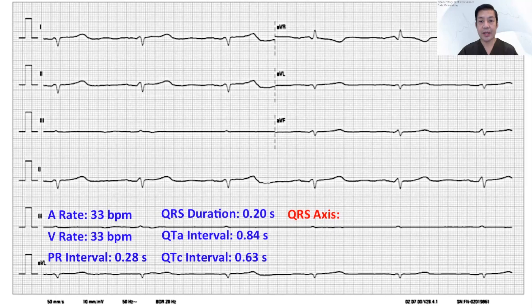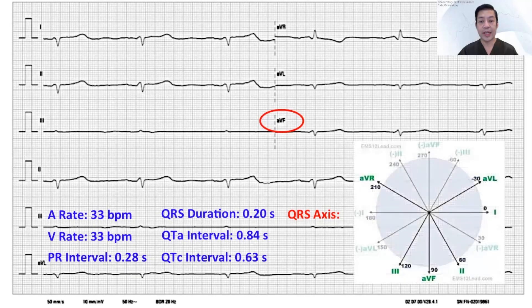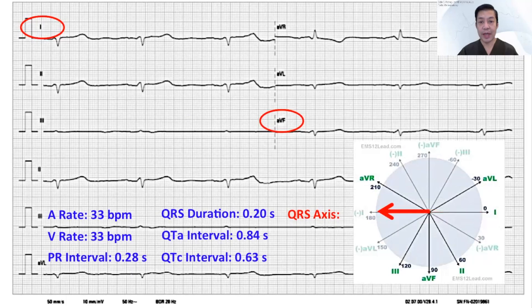Going to the QRS axis determination using the hexagonal system, we examine the limb leads and look for the lead where the QRS is most equiphasic. In this case, it is in lead AVF, where the amplitude of the R and the depth of the S are nearly equal. Looking at the axis, AVF is positive 90 degrees, and the leads running perpendicular to it would be lead 1 or its opposite. Examining lead 1, we can see it is predominantly negative, meaning the axis is going away from it — so the axis in this patient is positive 180 degrees.